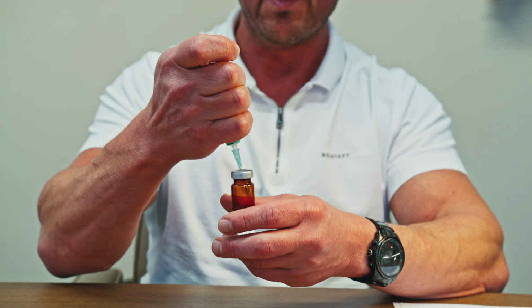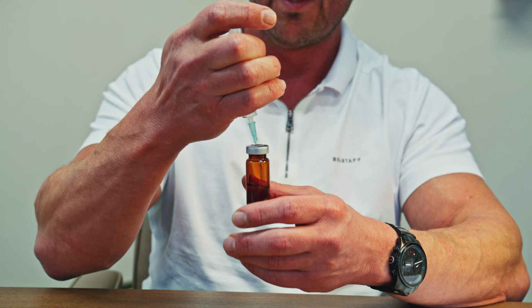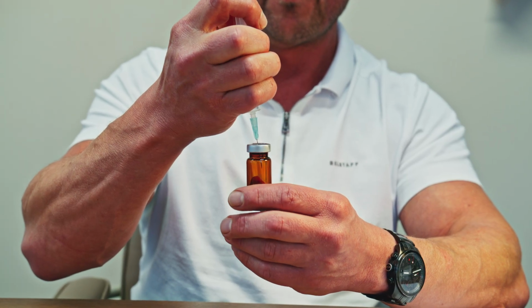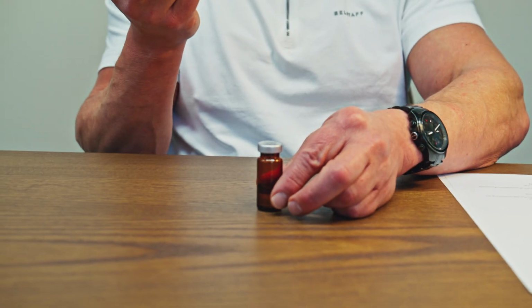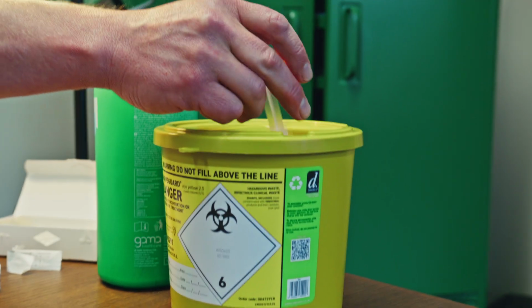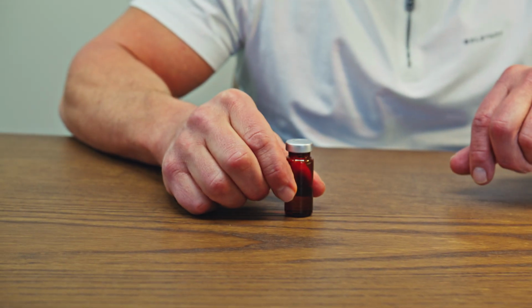So I'm going to take my thumb off the plunger. You can see the barrel of the syringe comes up because obviously we want to equalize the pressure. So it goes back up to 5, and when it gets to 5, I take the needle out. I dispose of the needle into the sharps bin. So what we have here now is 5,000 units in 5 ml of HCG.